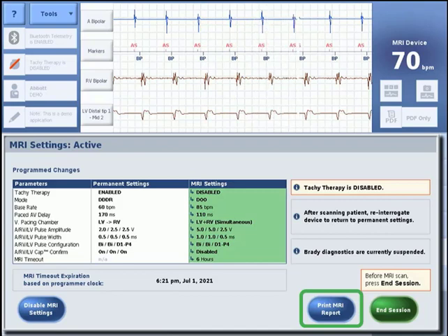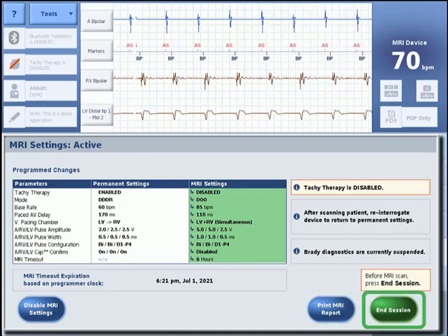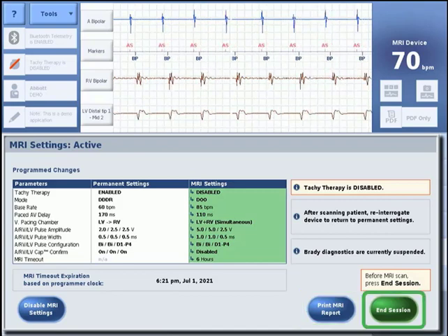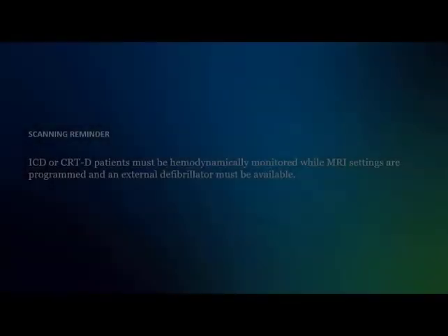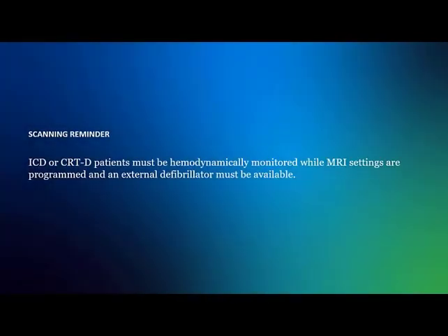To do this, press Print MRI Report. Finally, press End Session to end the interrogation session with the device. As a reminder, ICD or CRTD patients must be hemodynamically monitored while MRI settings are programmed and an external defibrillator must be available.